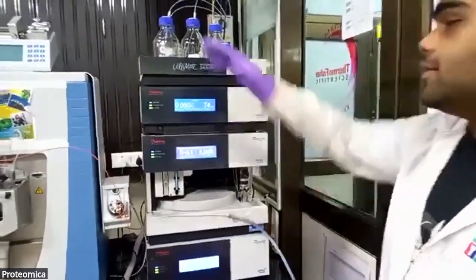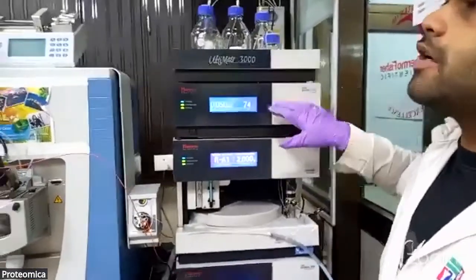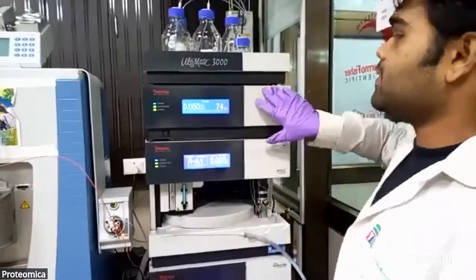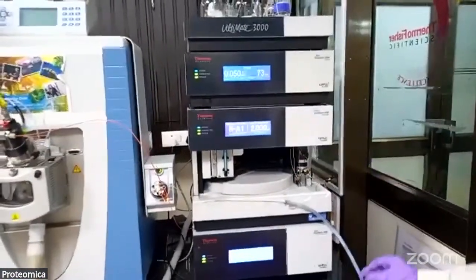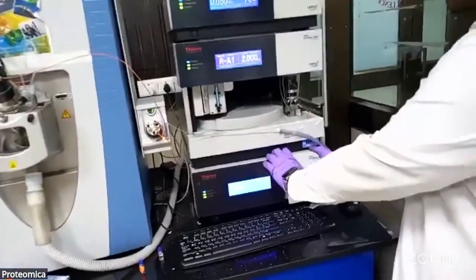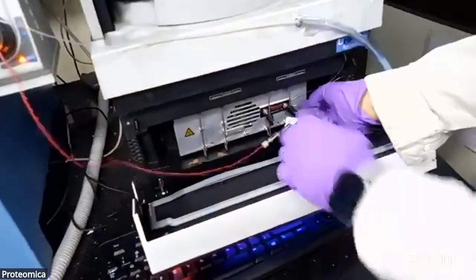Now the machine you are seeing here is the QE mass spec. It has two different mass analyzers, quadrupole and Orbitrap, and there are two different setups: one is the HPLC and one is the mass spec. In the HPLC, you can see three different compartments. The very first compartment is the column compartment. One of the key components of this entire system is the column here.